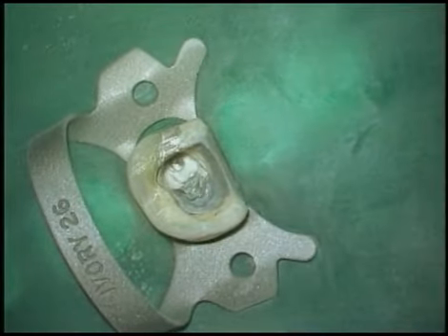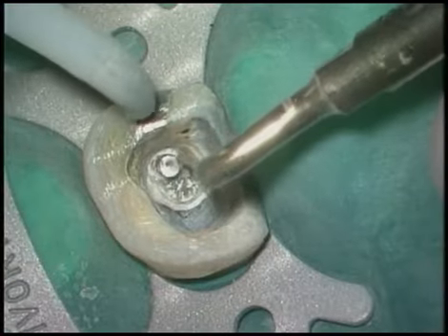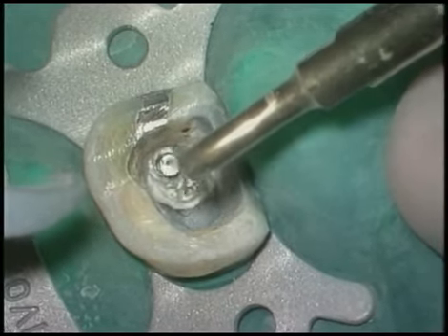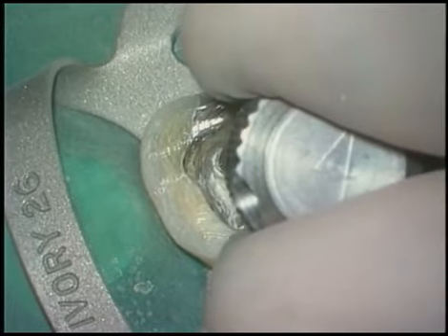Well, we just sheared off the post. Now we need to go back to ultrasonic trephining procedures, albeit more apically, so we can employ a smaller trephine and tap from the PRS kit. Again, turn the tap in small counterclockwise rotations to draw it down.